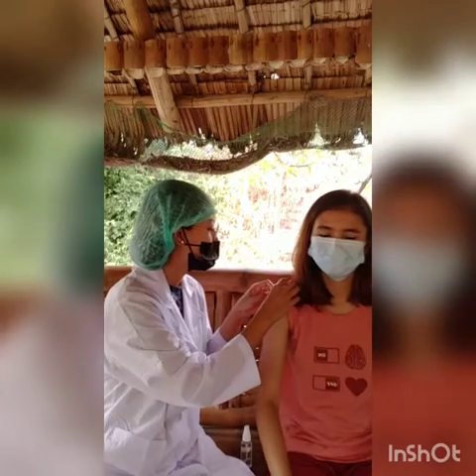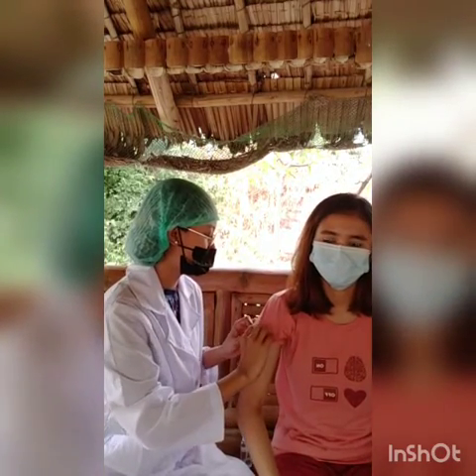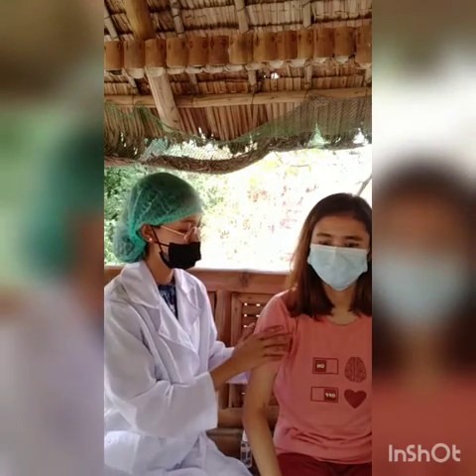And then after that is alcohol to remove all the microorganisms. And then after that, help the patient in the appropriate or in a comfortable position. So ayos po tayo, ma'am. And then after that is clean the diaphragm of the stethoscope with the alcohol wipe.